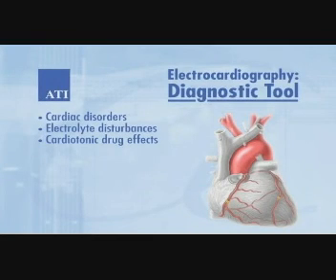Now, let's review the various cardiac dysrhythmias, beginning with the single most important tool you'll need to identify them. An electrocardiogram, called an ECG or an EKG, is a tool for diagnosing abnormalities in the origin and conduction of electrical impulses. It also provides diagnostic clues to various cardiac disorders, such as myocardial infarction, reveals the effects of some electrolyte imbalances, and assesses the effects of cardiotonic drug therapy.